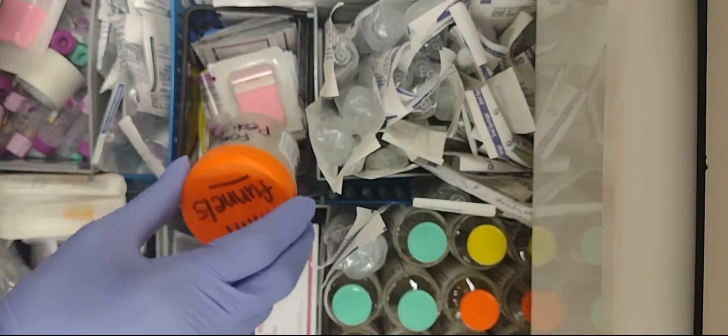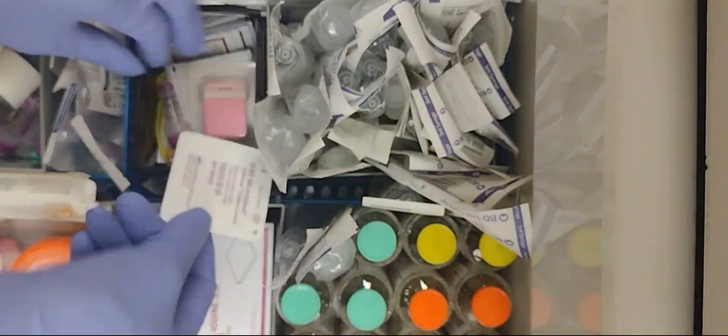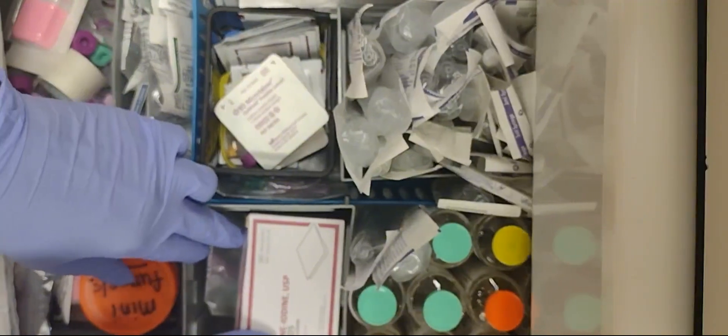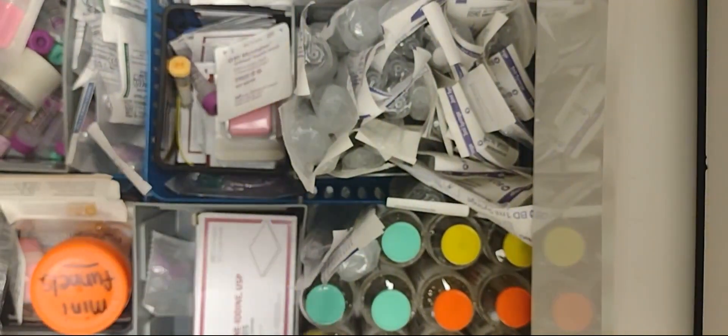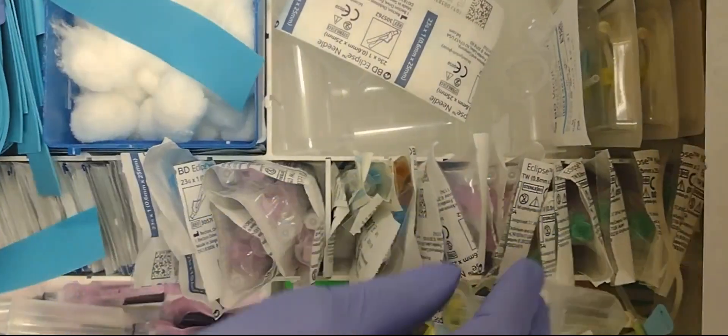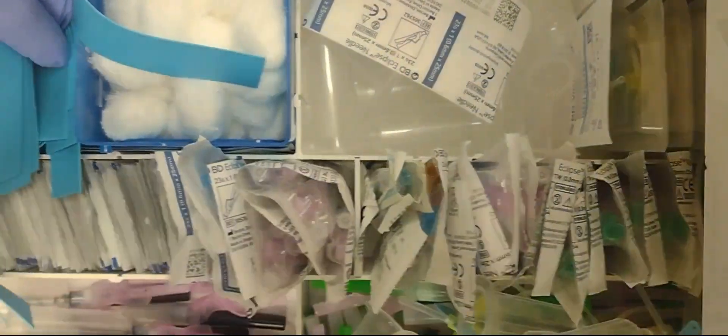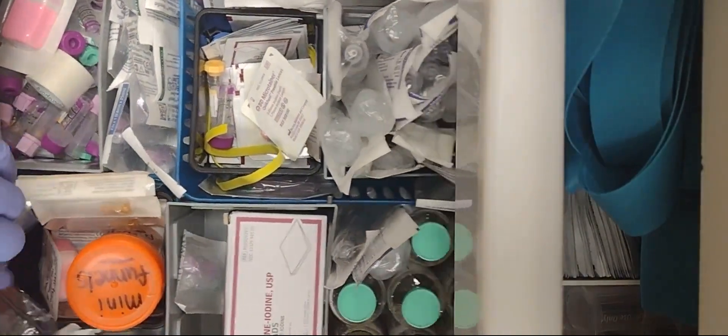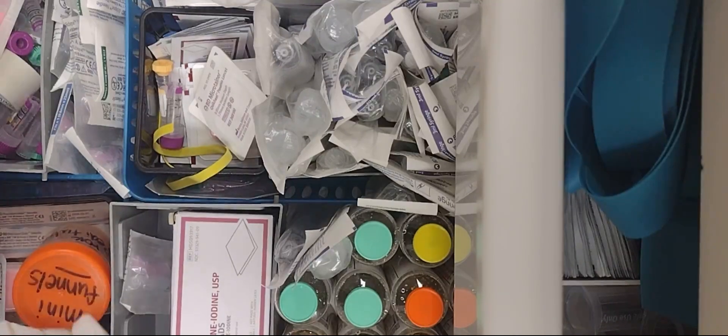These are for heel sticks on babies. We also have this one as well. These are povidone iodine pads. We use these if someone is allergic to alcohol. These are the small tourniquets for babies. In some circumstances, they will draw blood from the baby's vein, which is difficult to do. I haven't done that before yet, but in the medical field it's possible. I wanted to show y'all the regular finger stick lances. Those are heel stick lances.